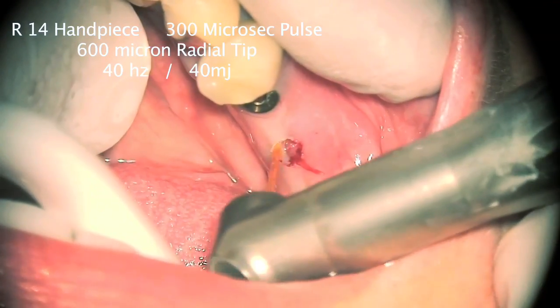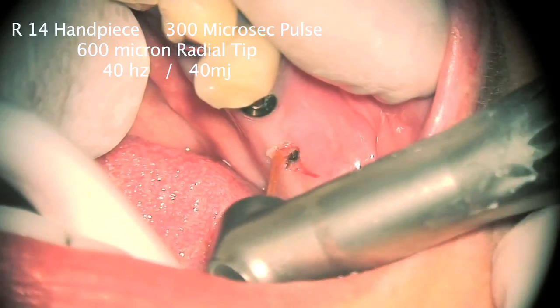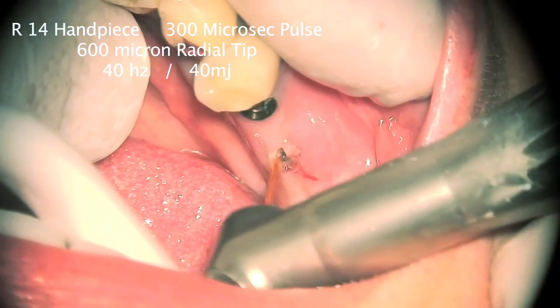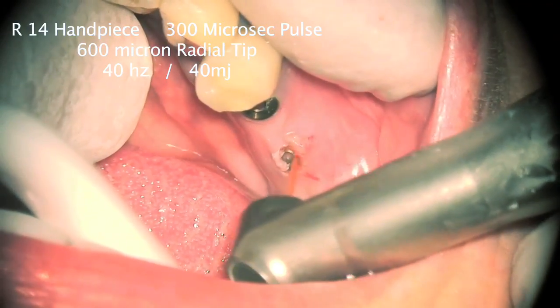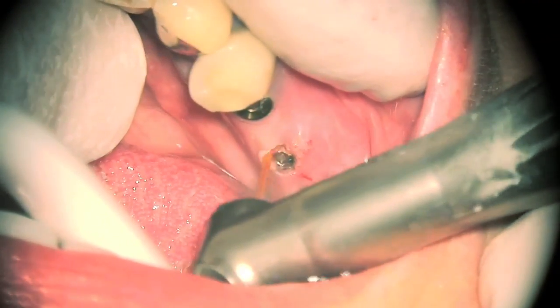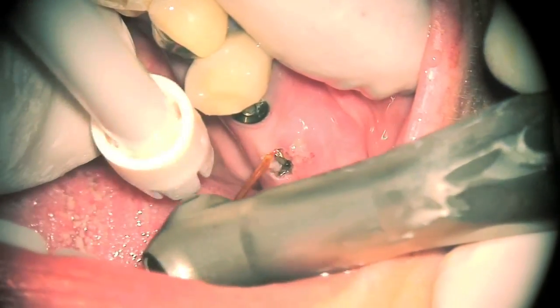Traditional implant dentistry is a two-step procedure. The surgeon uncovers the implant, places the healing abutment in, and sews it back up. You have to wait approximately two to three weeks before healing is complete.